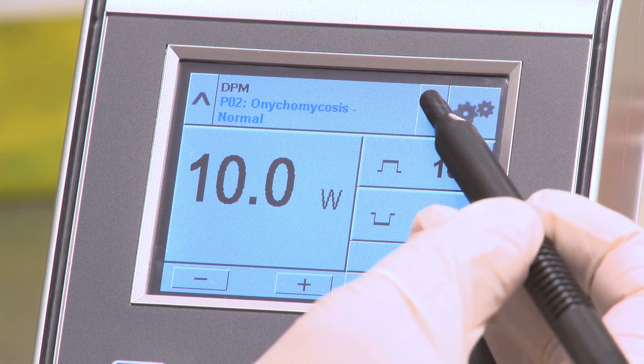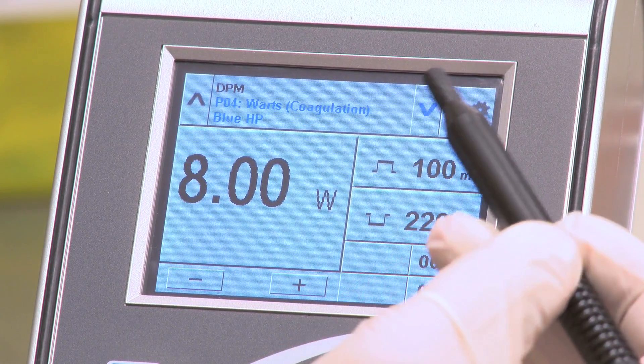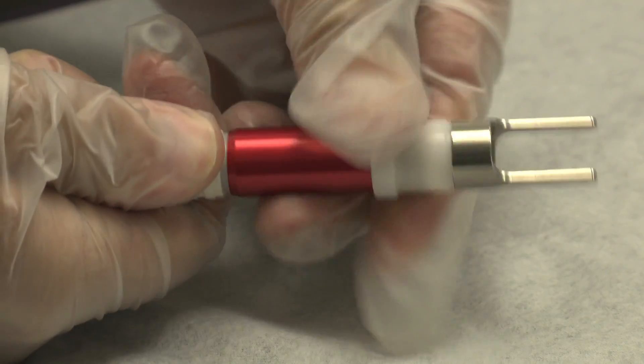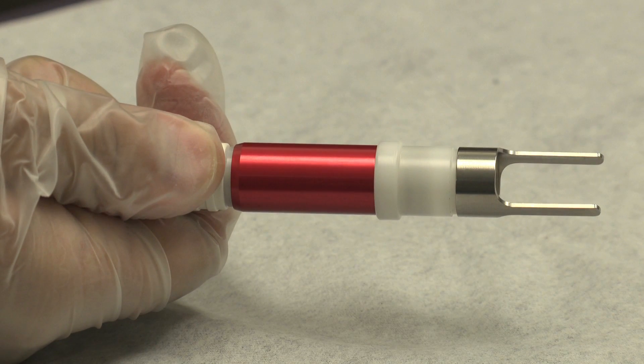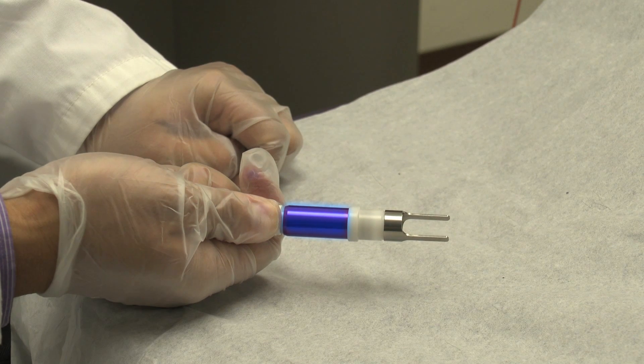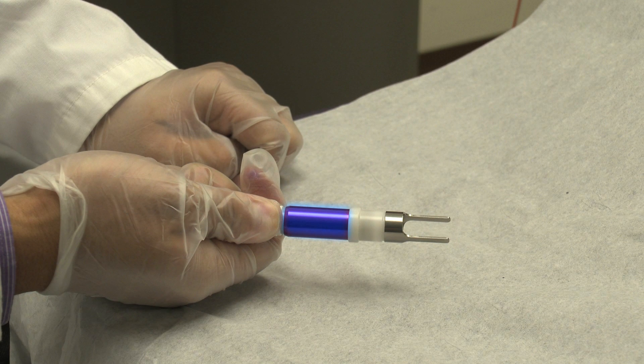Next, turn on the device and ensure the settings match the handpiece you have selected, red or blue. Red is more suitable when performing a milder treatment involving coagulation or drying out of the wart. Blue is more appropriate when a more concentrated energy is needed for carbonizing the root of the wart, as seen in this video.